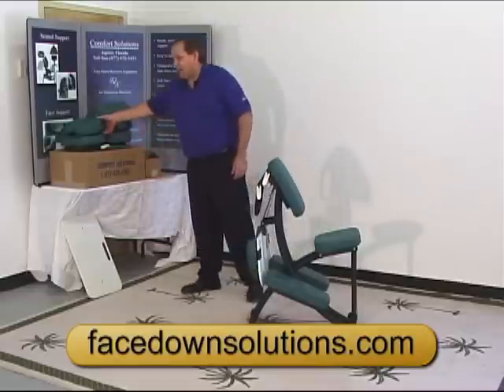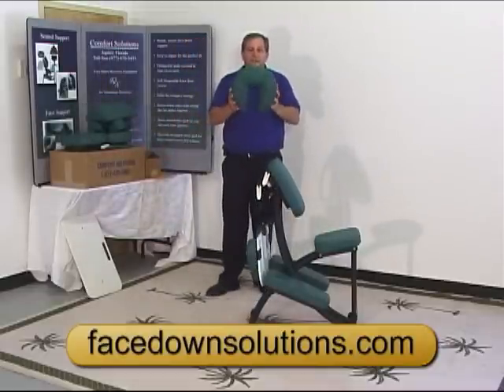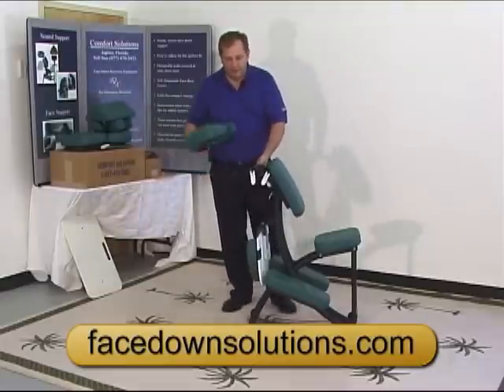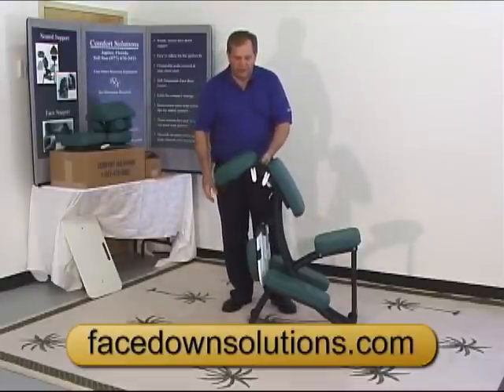The first thing we need to do is put on the crescent cushion for the face. This adjusts simply by spreading it out or squeezing it in for your face size, and it just sticks right on the face support cradle with Velcro, just like that.